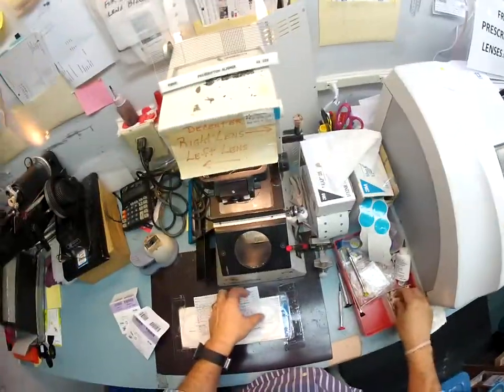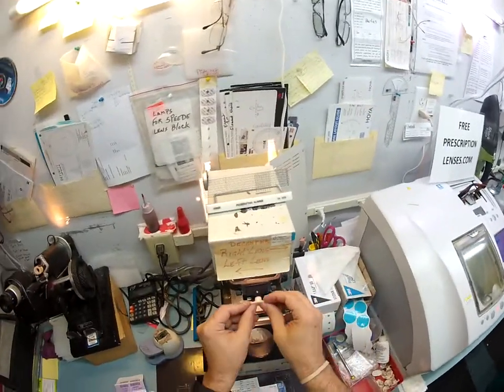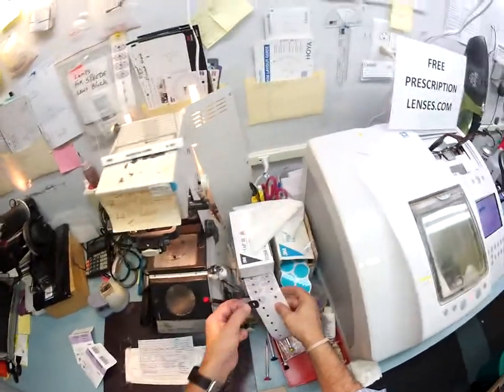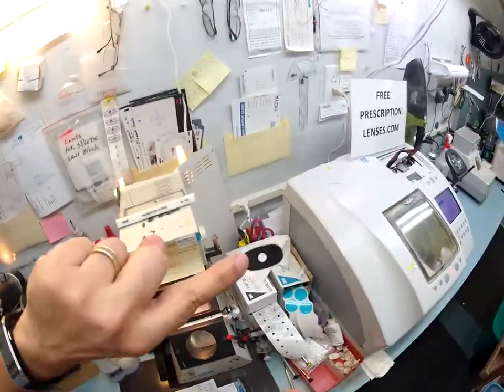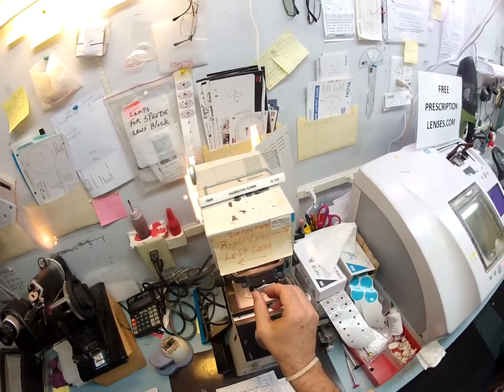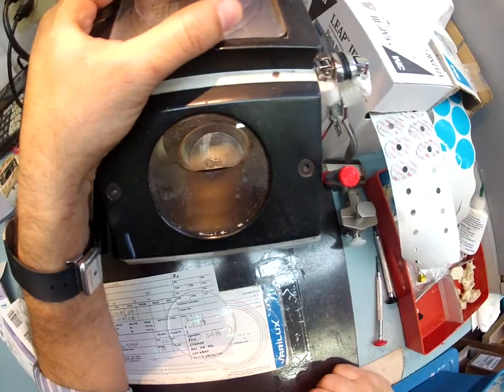Now I need to put a block on here while it's cutting. This is what's going to hold it in the lathe. So I'm going to put this block into my speedy blocker and pull the sticker off. It's got a double-sided sticker. The black side is the sticky side. I will stick that on one side, pull the tape away to reveal the other side, and I'm going to stick that down on the lens.